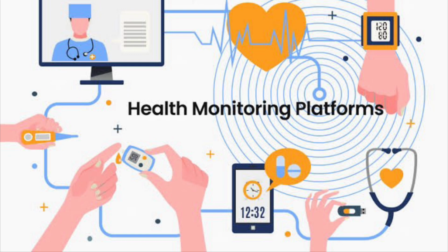The first step is to identify a need that you are addressing with your vital signs monitoring program. For example, it could be something like a lot of patients after surgery are coming back for readmission, or untoward events are happening at home after discharge in patients from a critical care unit or from the cardiac department. This could be one need that you need to address.